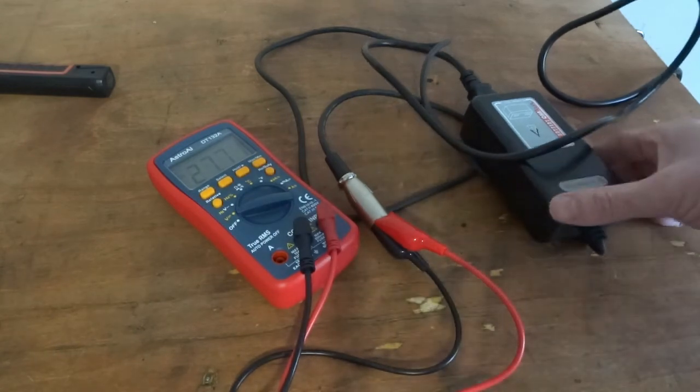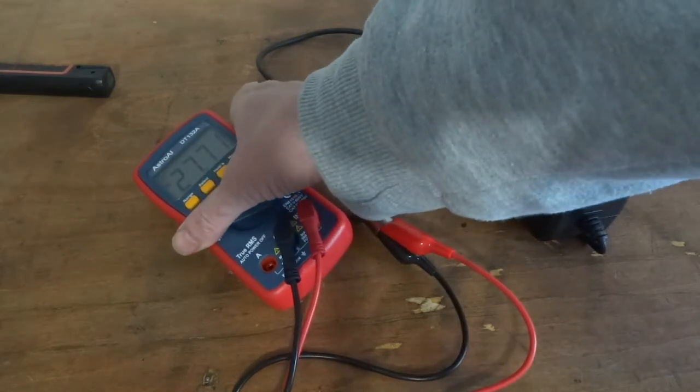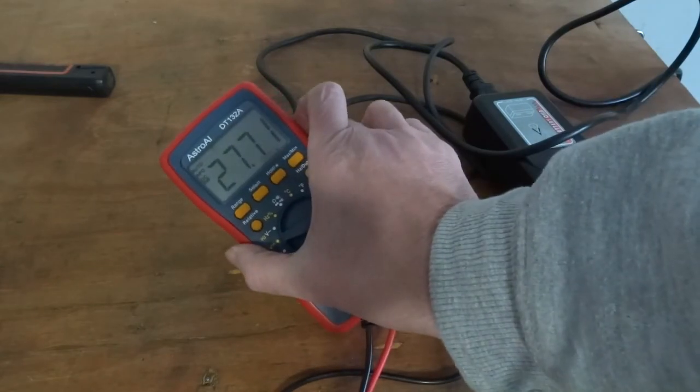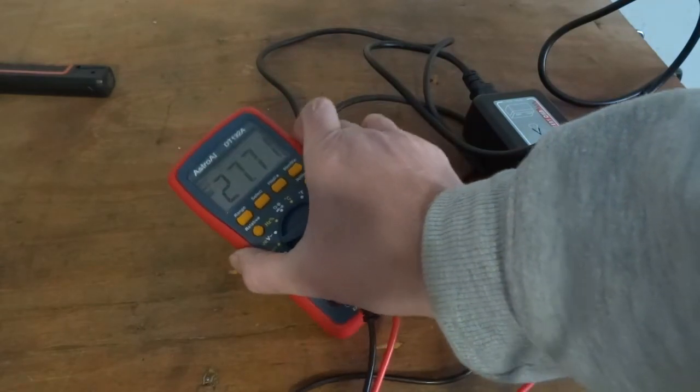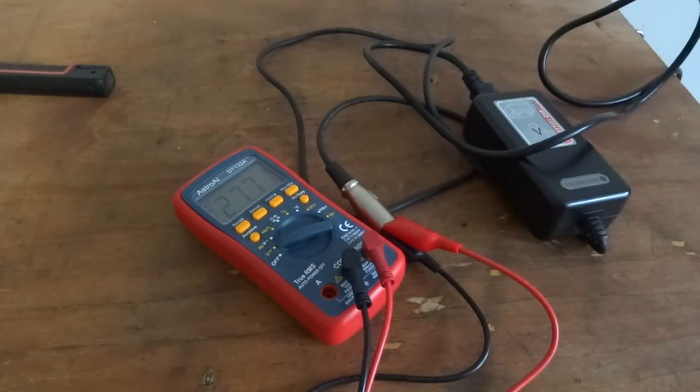So there you go. I've got 27 volts DC. So that's going to be a good charging voltage on a 24 volt battery system. So that's good.